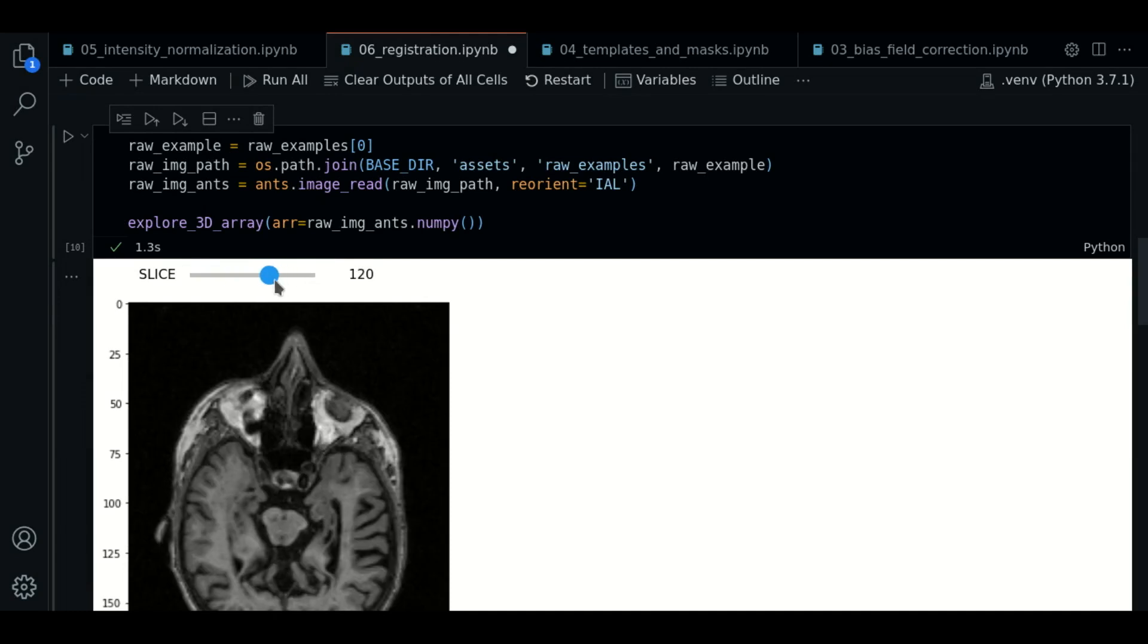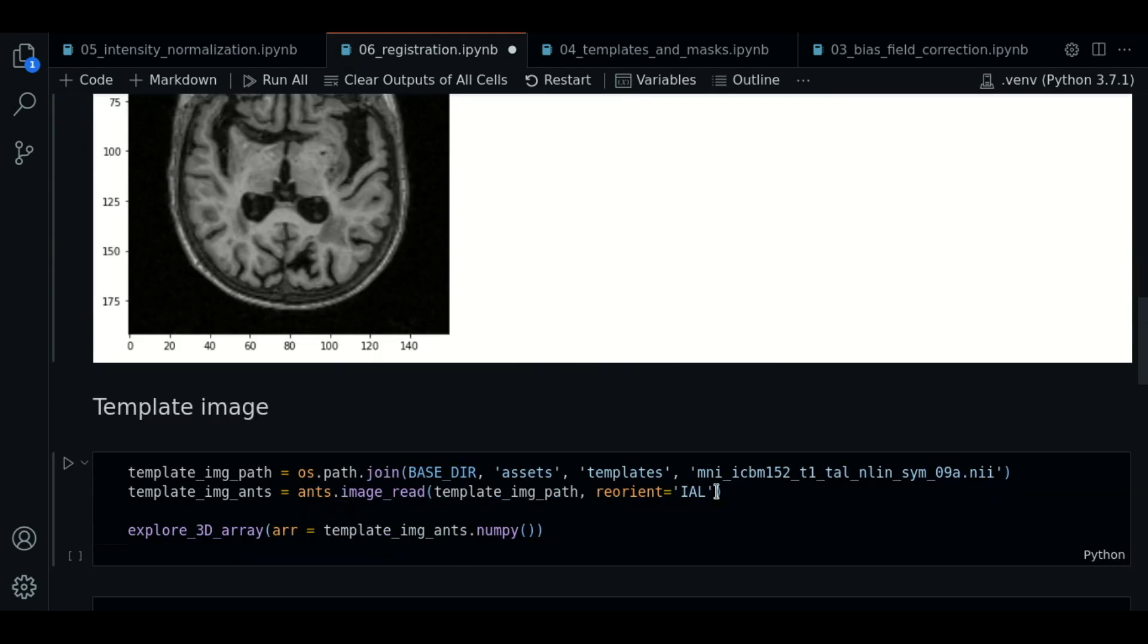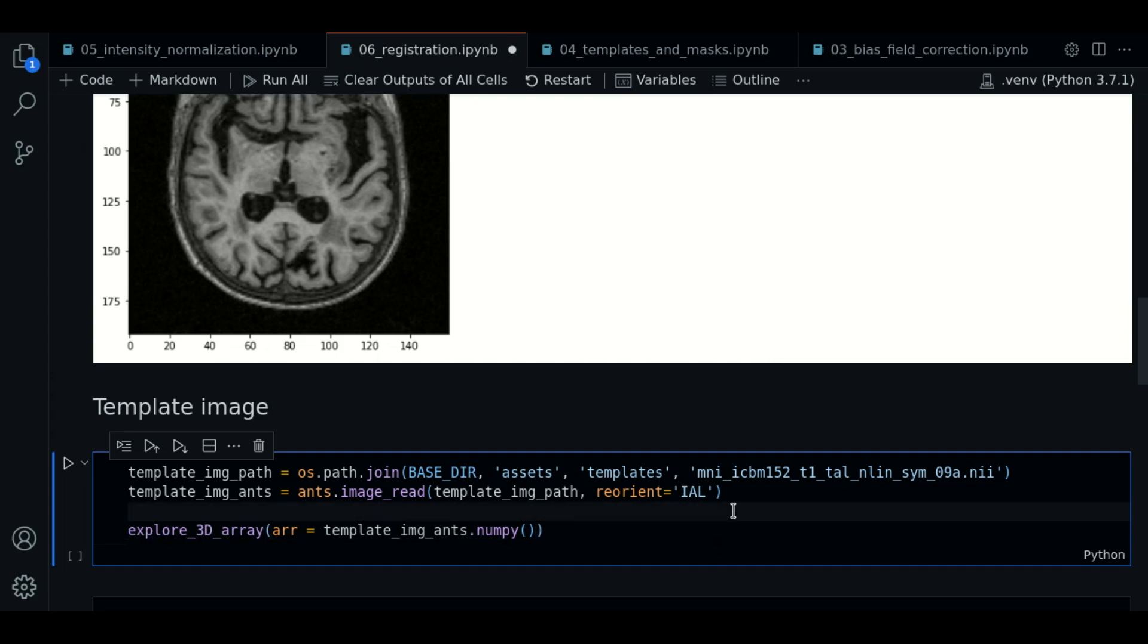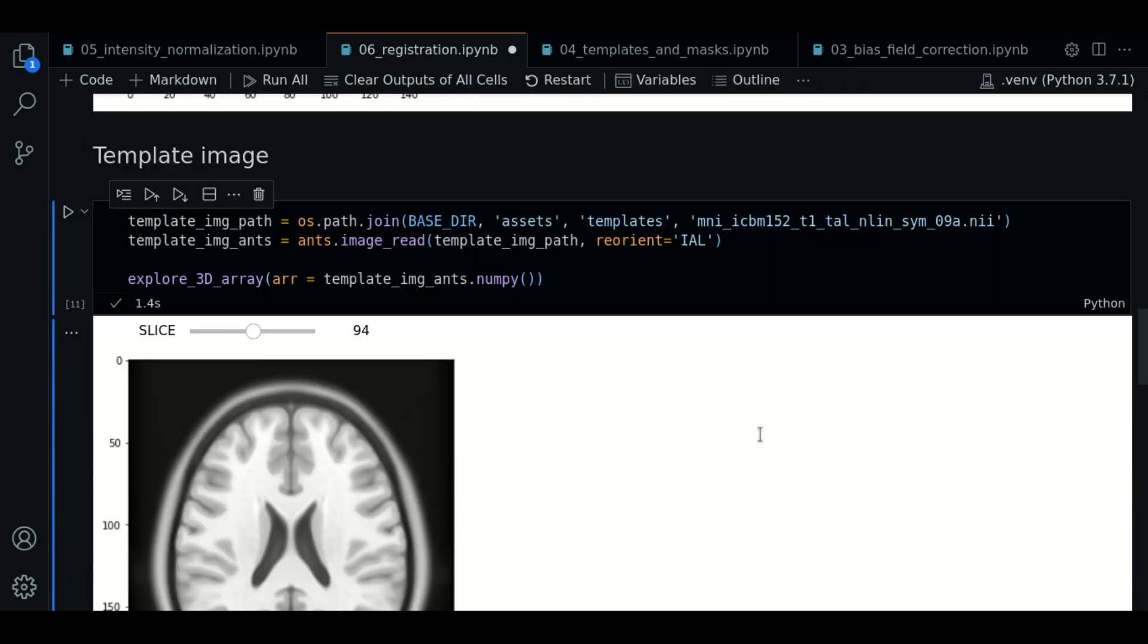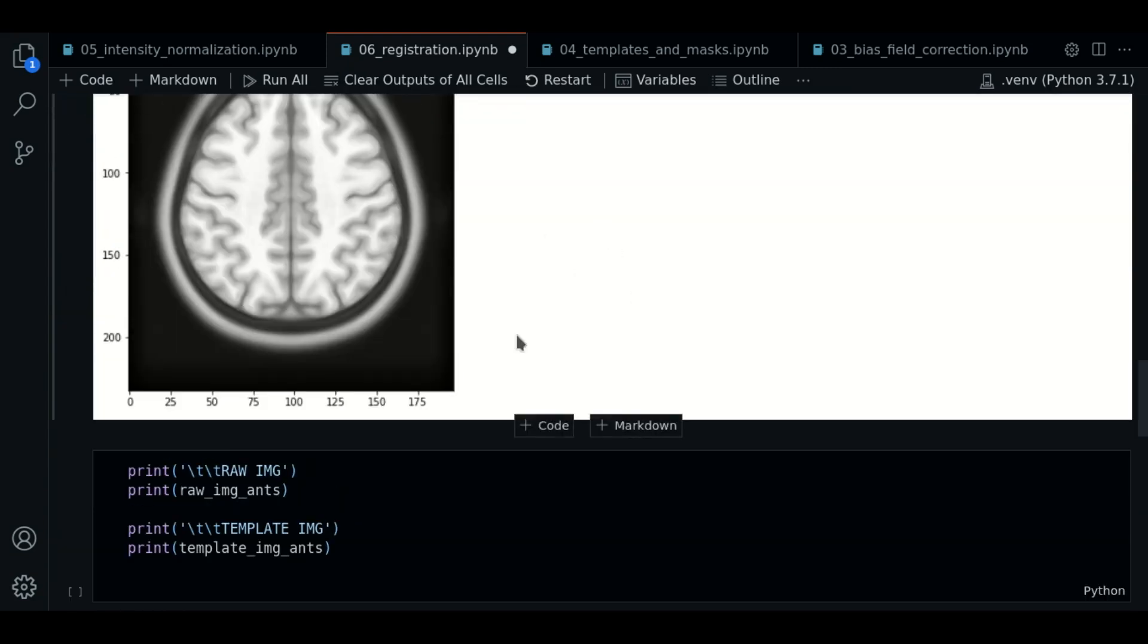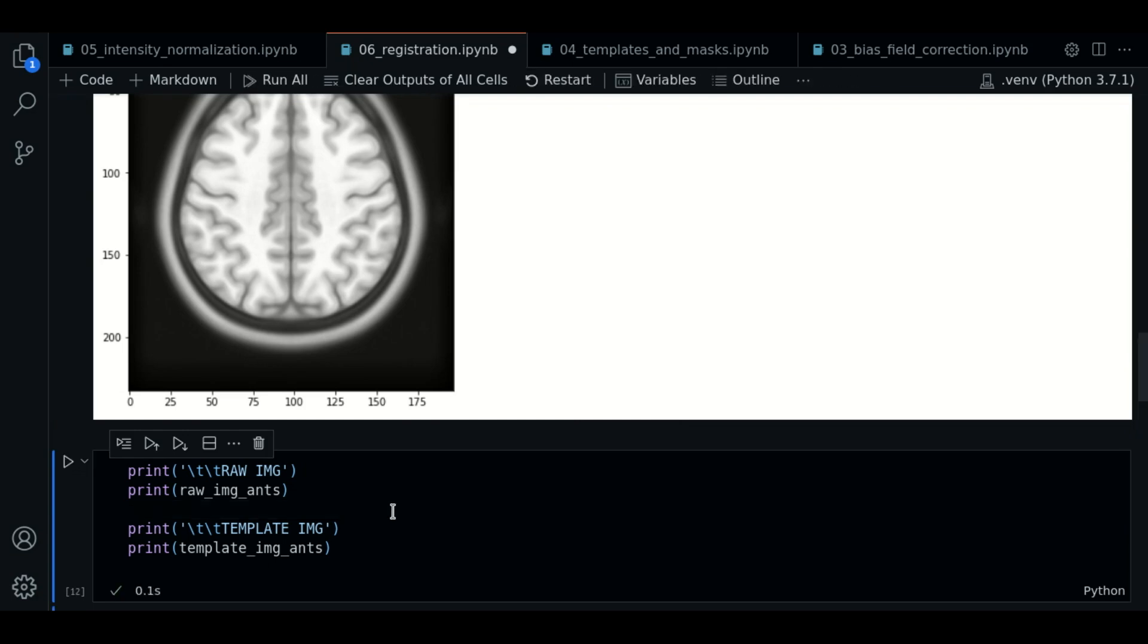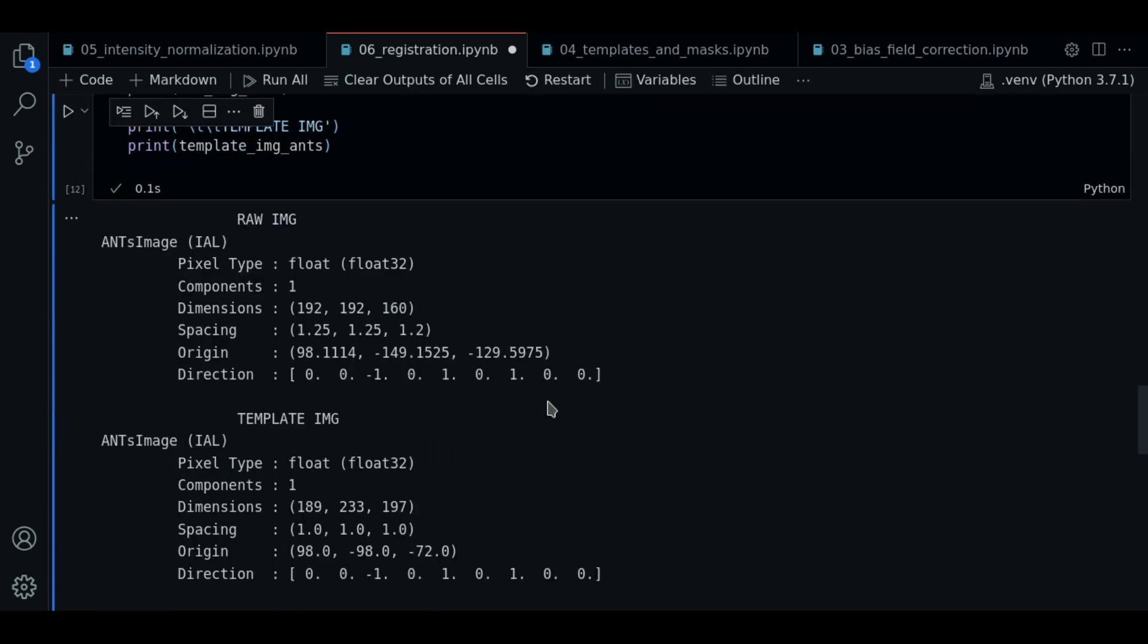We have loaded our raw example already. Now we load the template. Remember this template is the target image we will use to do the transformation. Before continuing let's check the information of the raw image and the template.